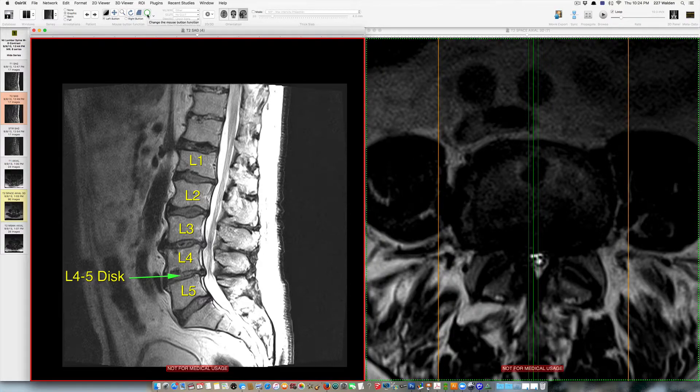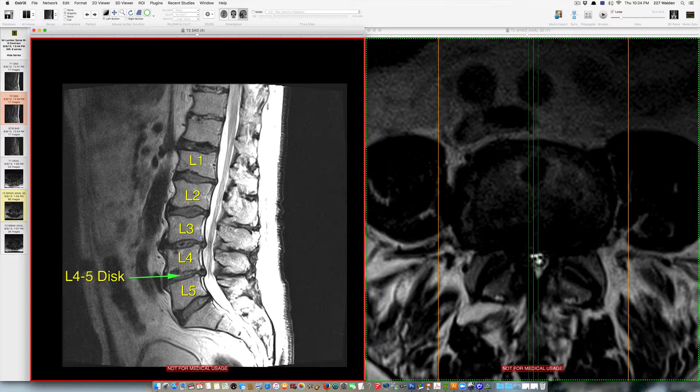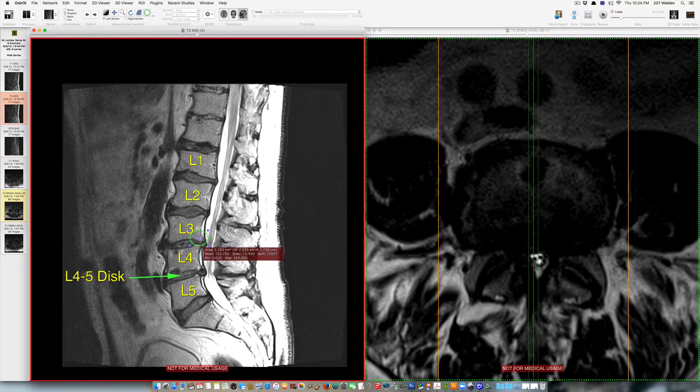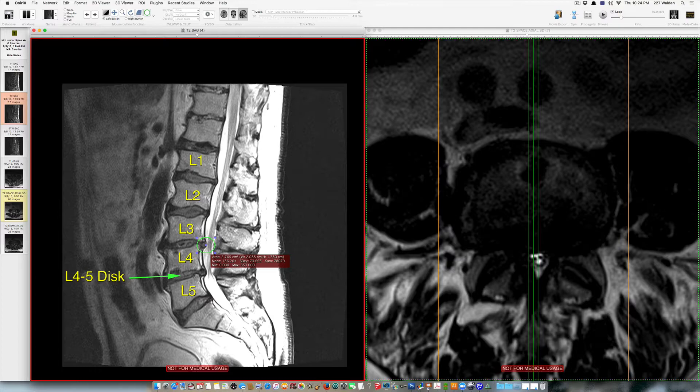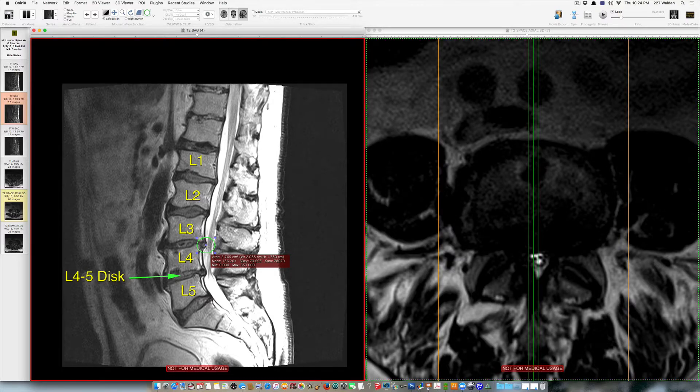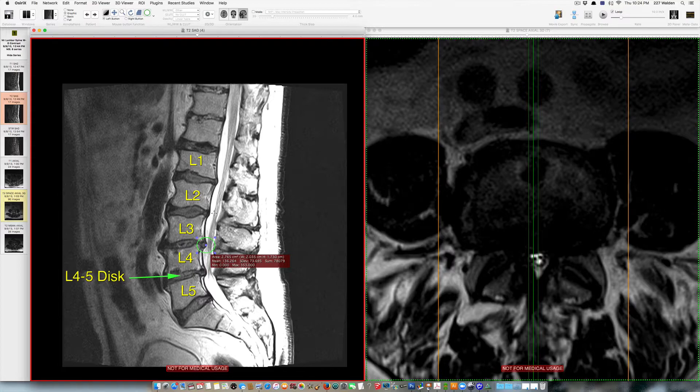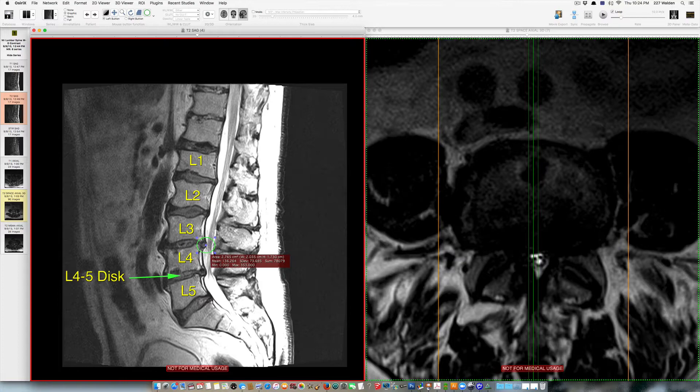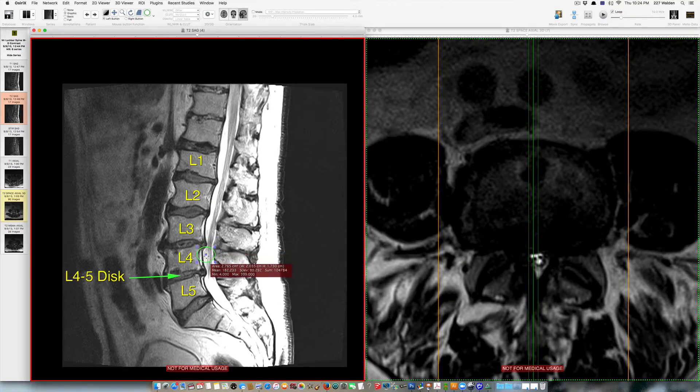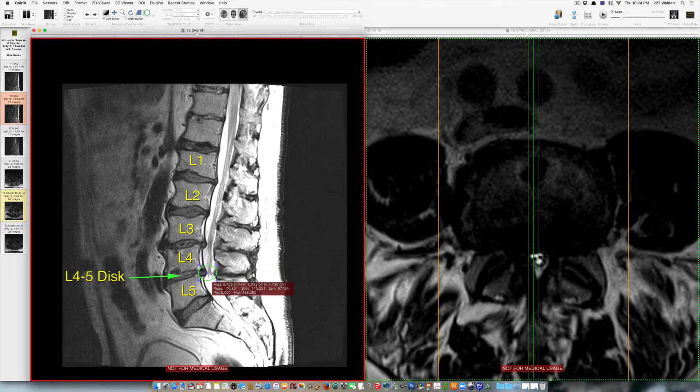I'm going to have to be a radiologist to appreciate that here at the L3-L4 level there's an area of spinal stenosis where there's an hourglass narrowing created by a broad-based disc bulge that's putting pressure on the nerve roots as they traverse that area through the spinal canal filled with cerebral spinal fluid. So there's an area of stenosis here at the L3-L4 level and an area of stenosis here at the L4-L5 level.